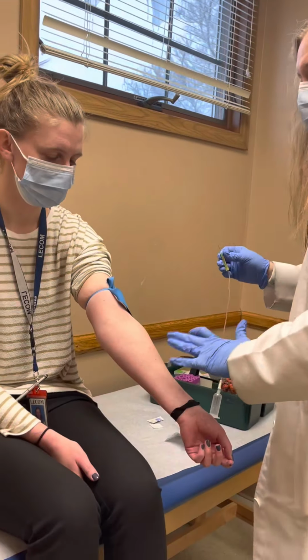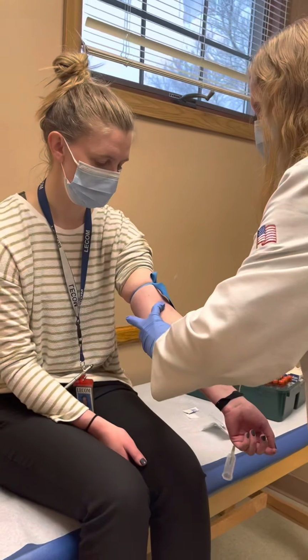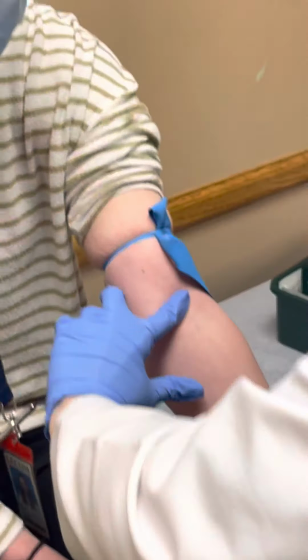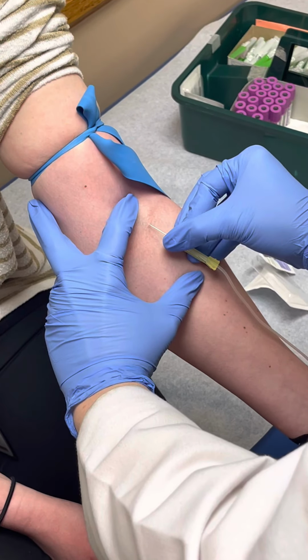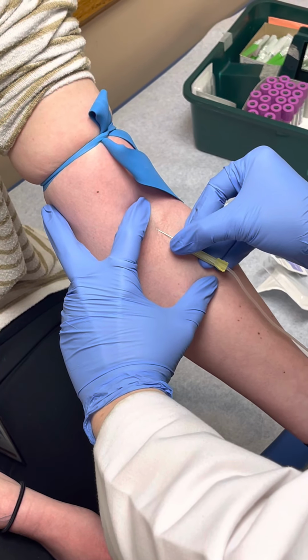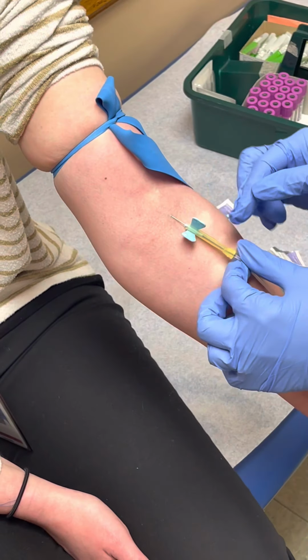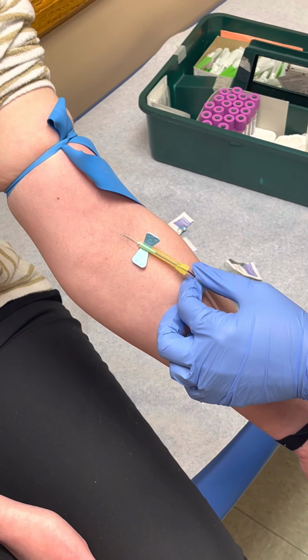Okay. All right. So now the area that we've cleaned, we don't want to touch it again because that will contaminate it. What we're going to do is pin down that vein. So we're going to feel above where the vein is to kind of hold it down. Then you're going to go in quick, but not deep. Again, about a 15 degree angle because this is superficial. So we're going to go right in, and you see this flash. That's how we know we're in her vein. See how we see this blood?